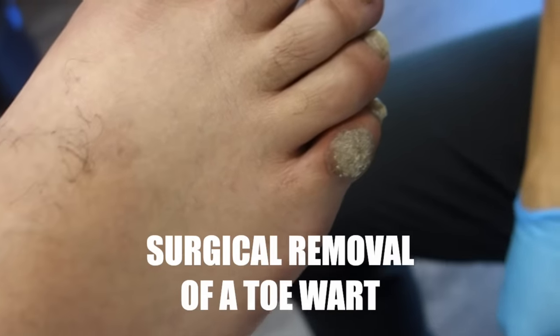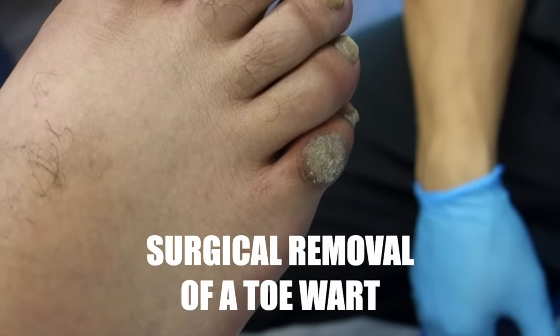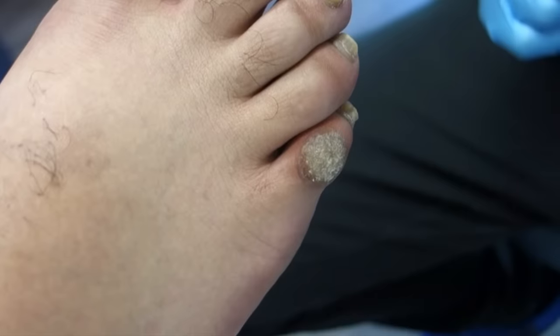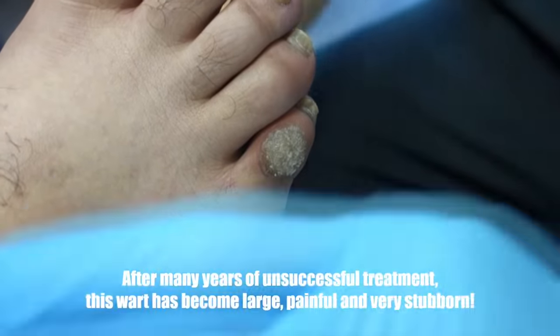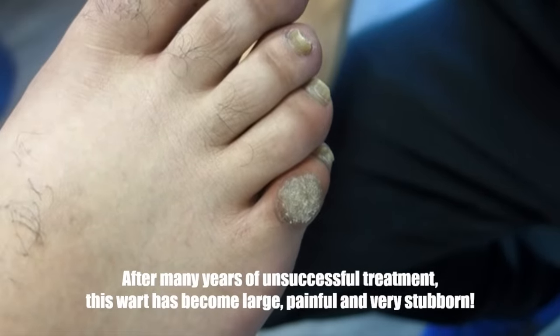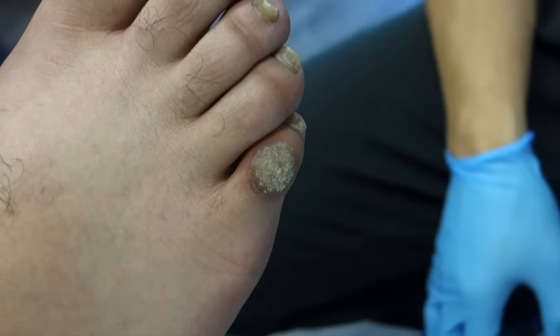This is how we're gonna make the injection as easy as possible. When I count to three, there's a pinch and a sting. If you feel like moving your foot on three, do not. What you're gonna do is push your heels straight down — not the toes, just here. If you feel pain, a pinch and a sting, then you're done.